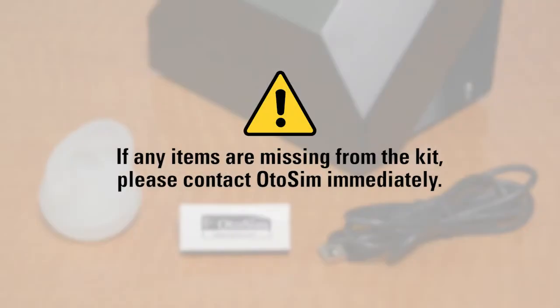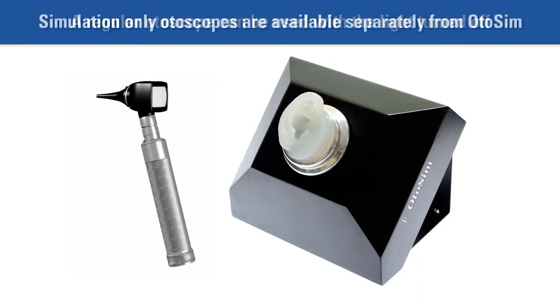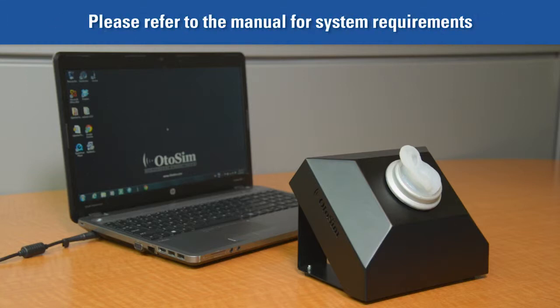If you did not receive all of the items shown here, please contact us immediately. Note: an otoscope is not included in the OtoSim system, but is needed to use the OtoSim for training purposes. You can use any regular otoscope without the light. We do offer simulation-only otoscopes, which are sold separately. Also note, a computer is required to run the OtoSim but is not provided. Please refer to the product manual to learn about system requirements for a suitable computer.